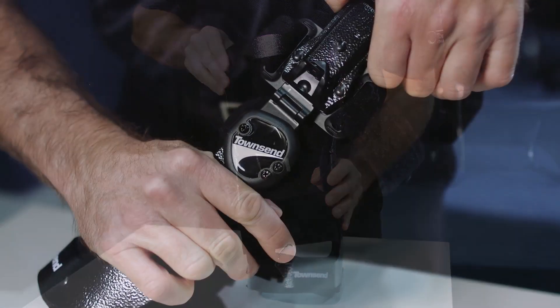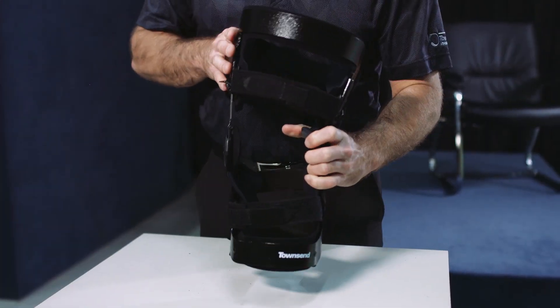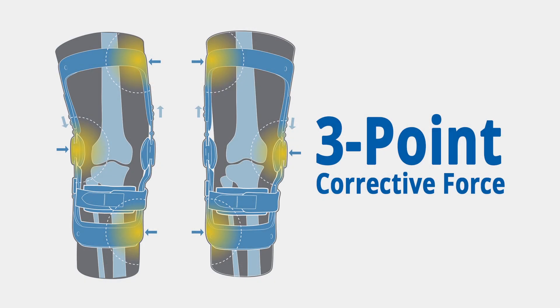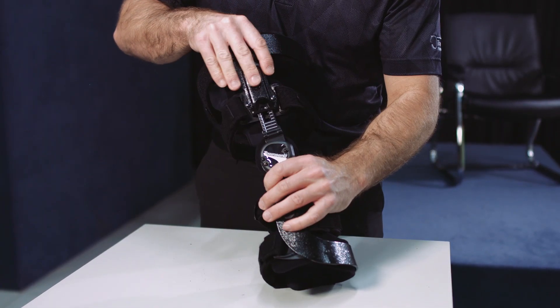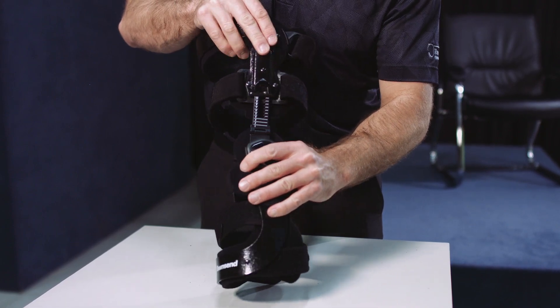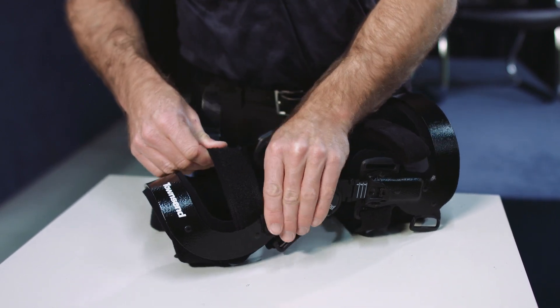The bilateral load shifters will allow you to shift the angle of the femoral shell to increase correction and amplify the three-point corrective force system needed to decompress the affected compartment. The Rebel Reliever is packaged with both load shifters in the neutral position halfway up the slotted side mechanism. Open all the straps and unlock both of the load shifters on each side.